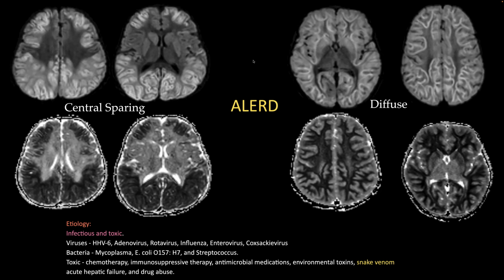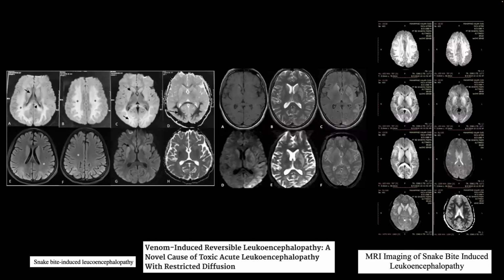So obviously, it's a neurotoxic venom. It has caused respiratory failure, and then before he could be ventilated and stabilized, he probably had hypoxic injury. Yeah, and that is what we thought. So it's a combination of hypoxic injury with this reversible leukoencephalopathy, or leukoencephalopathy related changes related to the venom toxicity, which you're seeing on the scan, I guess.